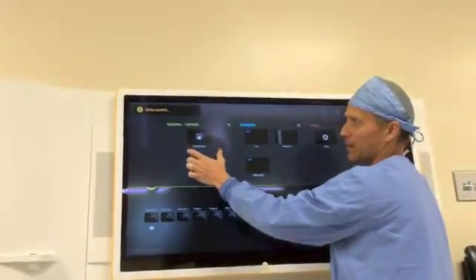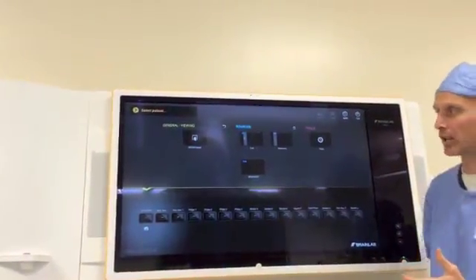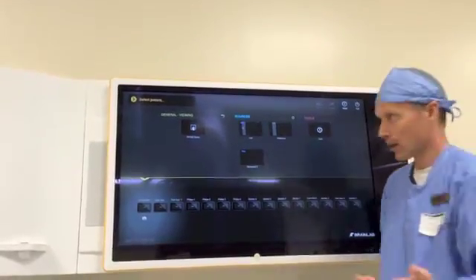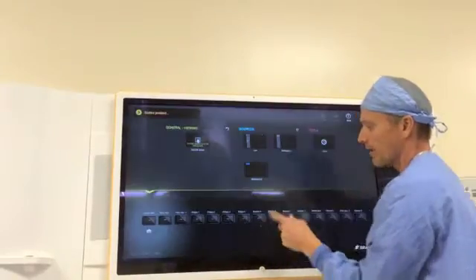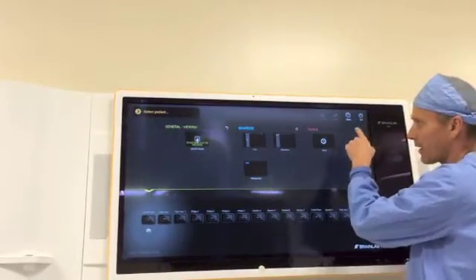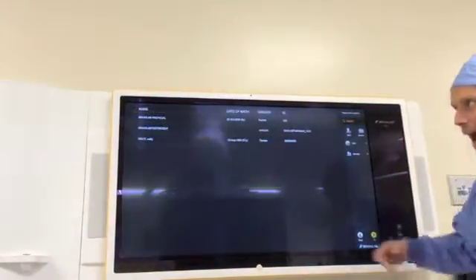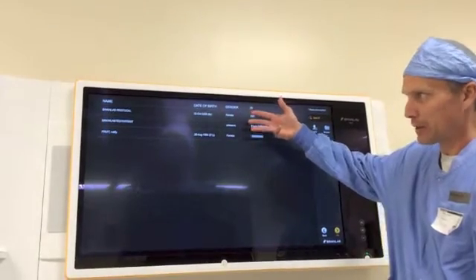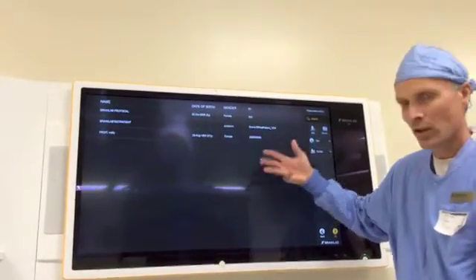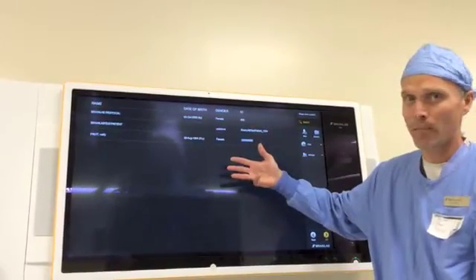From the BrainLab side, BrainLab has a DICOM viewer with PAX integration. The first thing we'll want to do is queue up our patient scan. If I hit Select Patient, it's going to open up the local cache. This is what we're seeing — there's only three patients loaded up on the local cache. If you don't see your patient, that just means we haven't pulled it down from PAX yet.